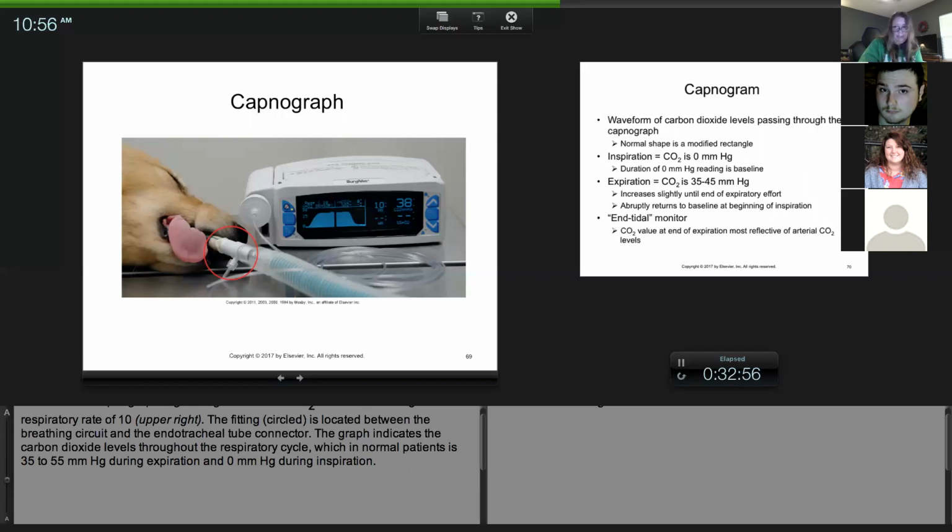If you've ever looked at a machine, when you've seen us at school, there's a little canister. It looks like it has white gravel rocks in it, or if you've worked at a clinic, that is called the soda lime. When an animal breathes in and out through an anesthetic machine, those little granules absorb exhaled CO2. So when the animal inhales again, they don't re-inhale CO2. Say I had an inhaled or inspired CO2 of like 10, 15, 20. I'm like, why is my animal inhaling CO2? It could be that those granules have to be changed on a regular basis. If those granules are expired, when the animal exhales CO2, it's not being removed and it's going back to the patient.